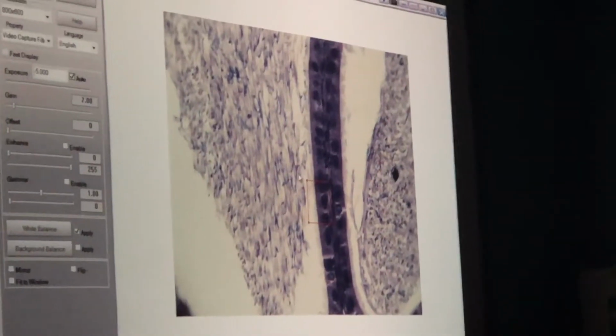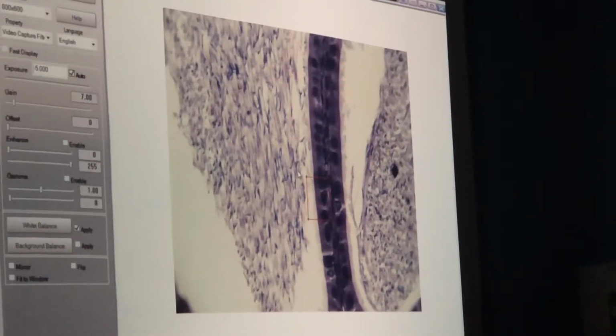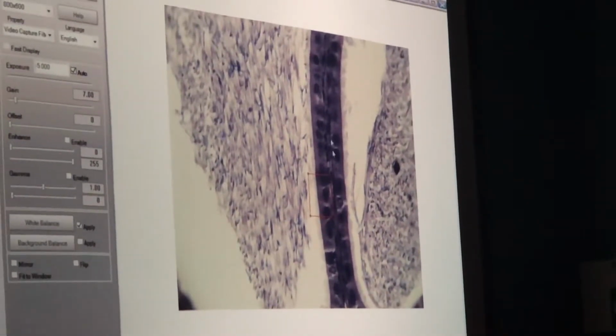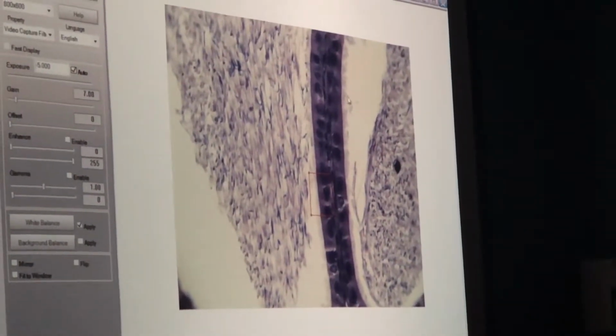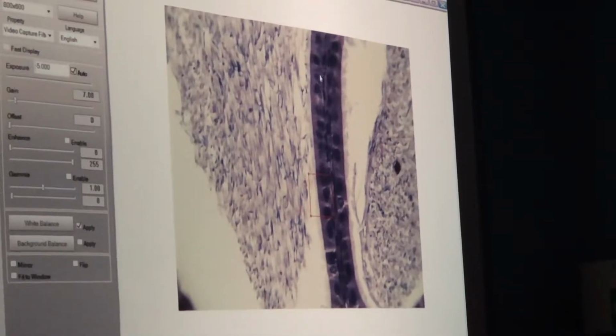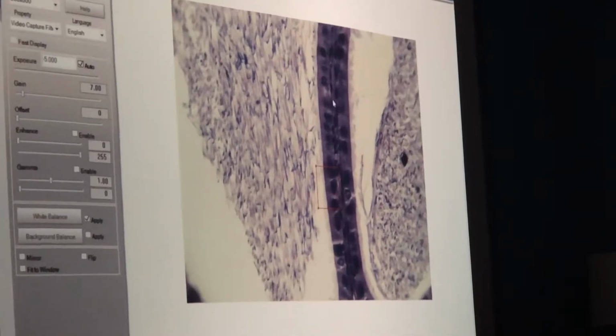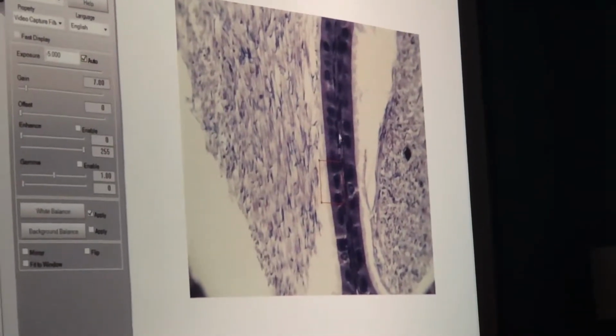When you look at the testes, you don't see columnar cells. You just see those spermatogenic cells that basically look kind of round. So that's really different. And here would be one loop through an epididymis. This would be a loop through another segment of it. And then in between them, what are we going to see? What kind of cells?